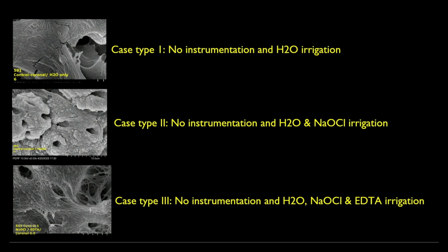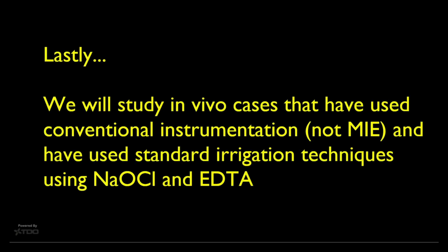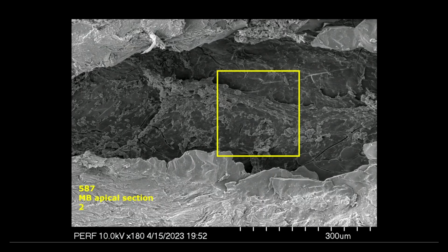And after looking at those cases and developing some pattern recognition on what control cases really look like, then we'll go look at some conventional instrumentation cases, not MIE cases, but conventional with standard sodium hypochlorite and EDTA. And Pushback has sent me some of those cases.